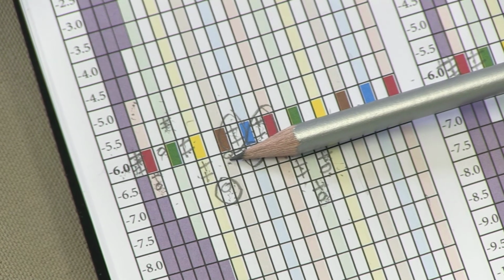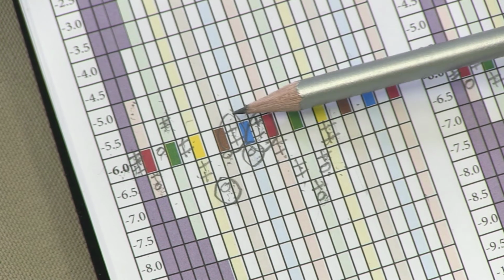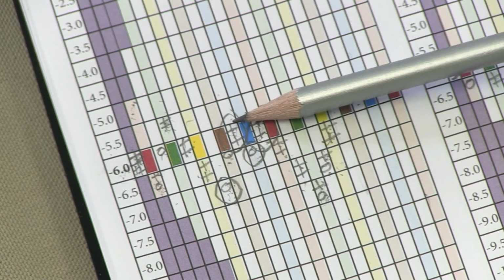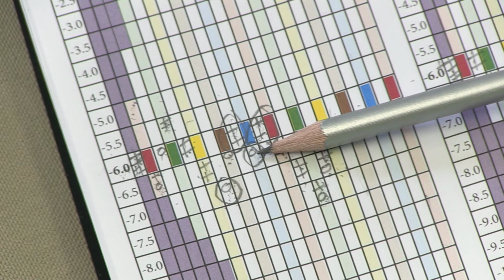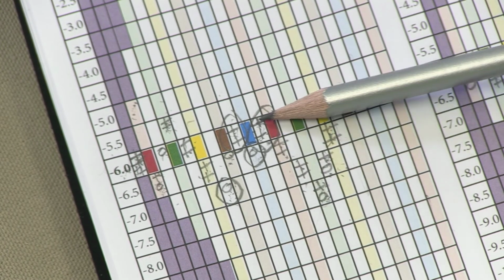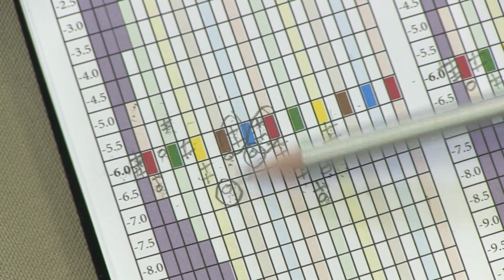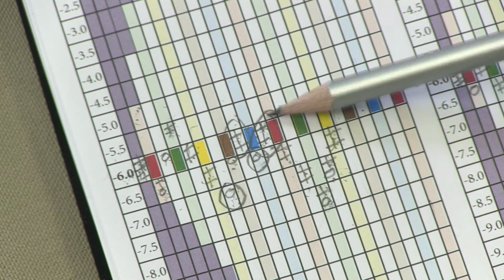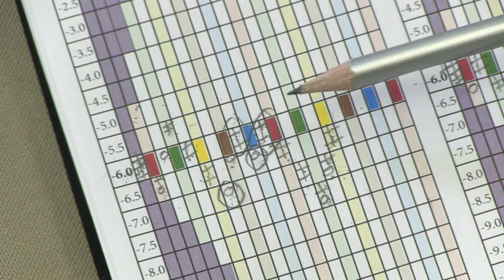Same thing happened there. We presented 2 stimuli. There was a miss on the first set of pairs, so we moved back up. Then at the next step, we got 2 sets of pairs correct, so we moved down. We moved down, and then we missed the first pair, so we didn't give the second pair. We moved back up. So ultimately, we ended up with 1, 2, 3, 4, 5, 6, 7 reversals, and that's where we'd ordinarily stop and average the data. Typically, we only do 7 reversals, but for the demonstration here, I've done 9 just to show you how often these threshold values look.